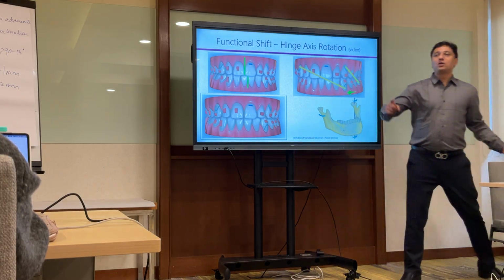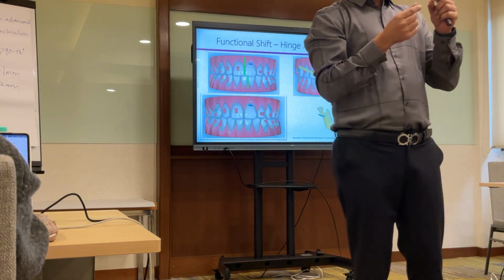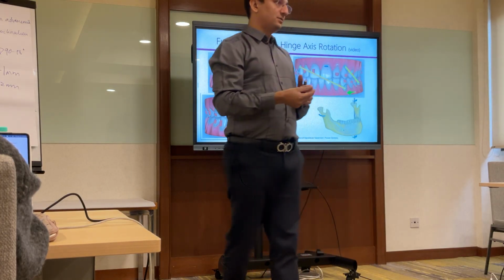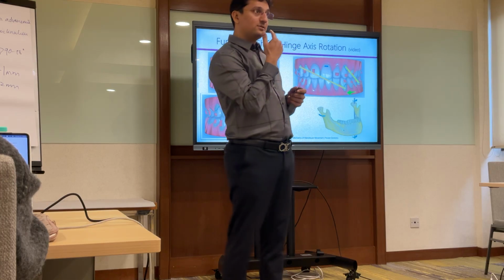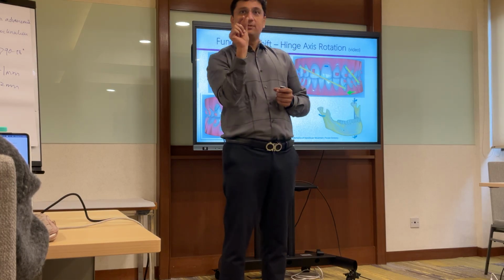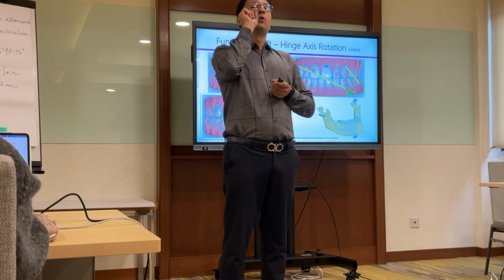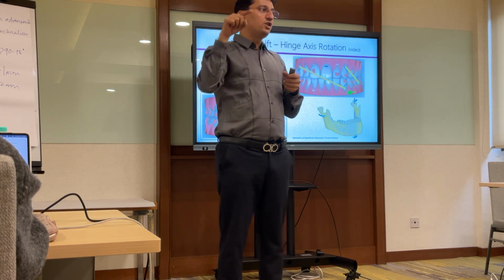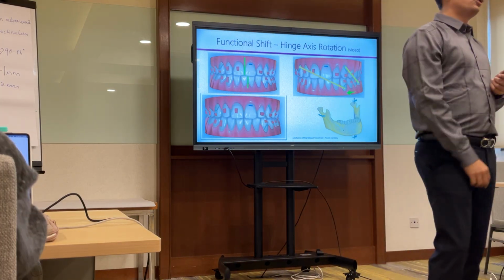So you have a small handle and you have a lot of attachments. You put the attachment in it and you have different types of attachment. One is for your button, one is for your cleat, one is for your tongue trainers, depending upon the shape you have inside. You fill composite, etch it, bonding agent, cure it, put it there, cure it, and remove the attachment. You will have a beautiful shape of it. Just wondering how come you guys are not aware of it. You should know it.